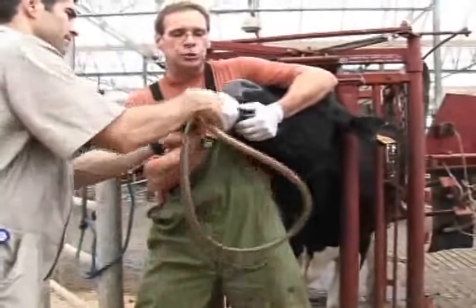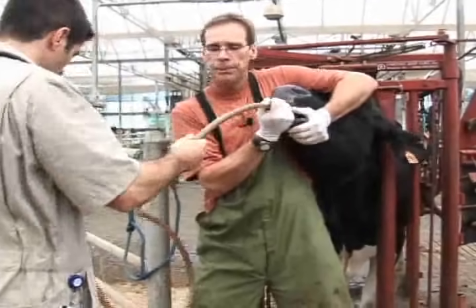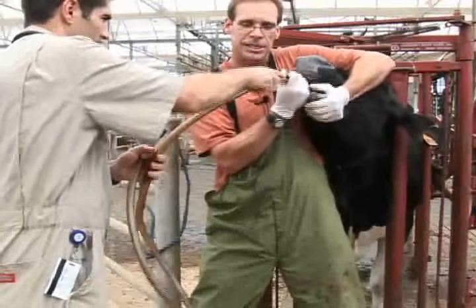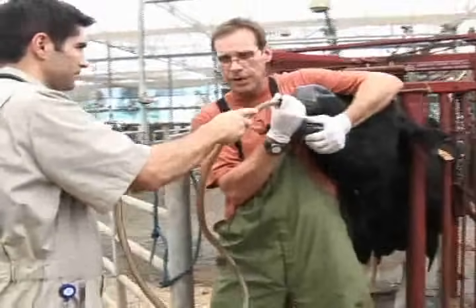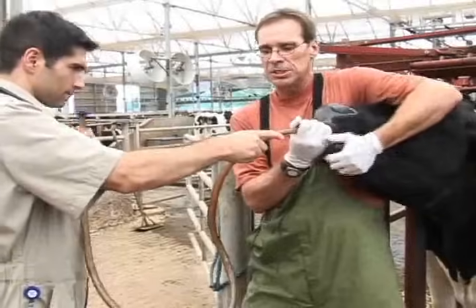Now we'll insert the tube slowly but steadily — negative pressure confirmed, perfect. Continuing — resistance is there, resistance felt clearly. Now listening — air gurgling very nicely, air confirmed. If it's a sour rumen you'll most likely pick up a pretty sour smell as well.